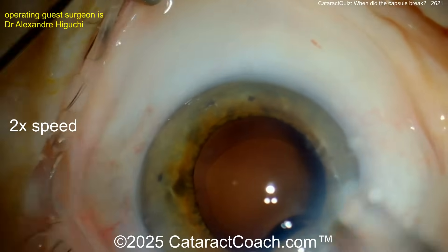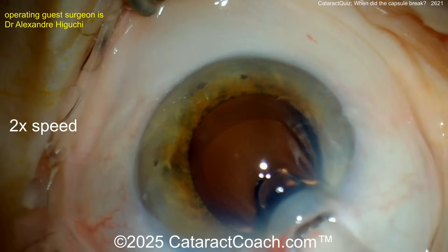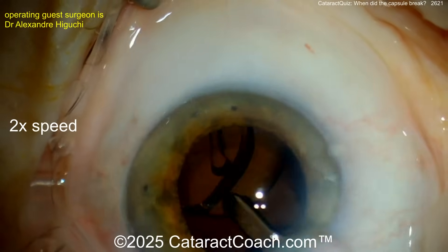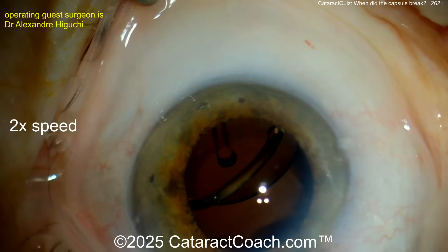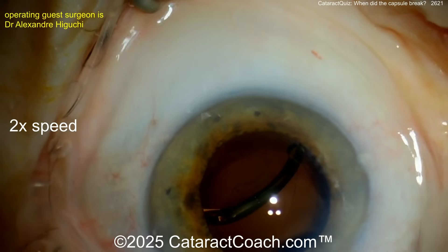Viscoelastic is placed and the lens comes in. The surgeon at this point still doesn't realize. Watch carefully — the lens goes in and it's a toric trifocal, but it just looks too deep. It's not centered at all. Whoa — where is that leading haptic going?